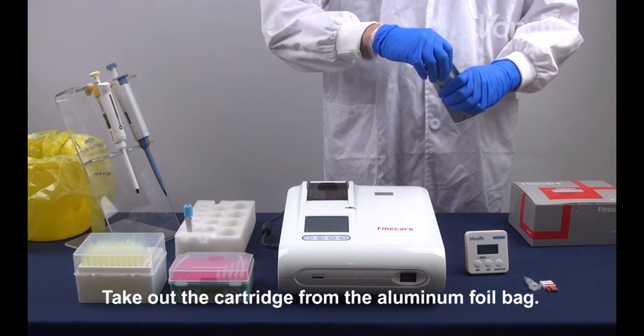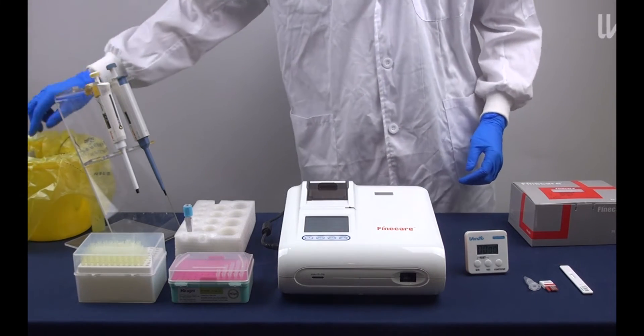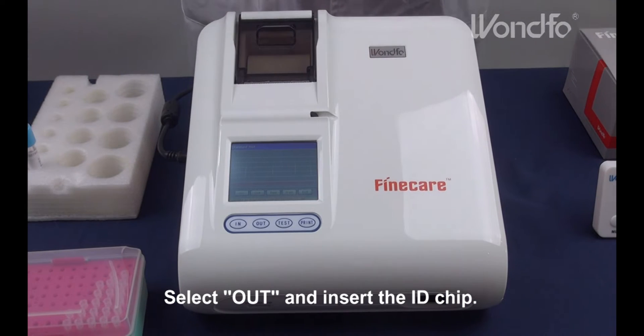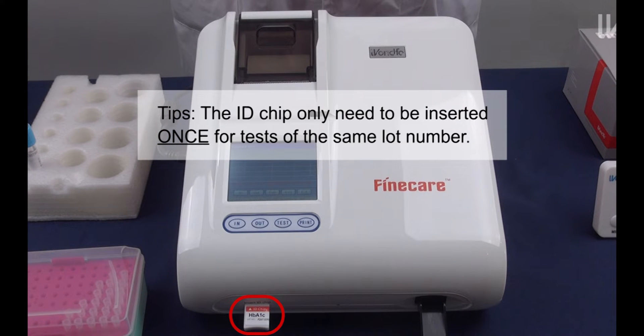Take out the cartridge from the aluminum foil bag. Select OUT and insert the ID chip. Tip: the ID chip only needs to be inserted once for tests of the same lot number.